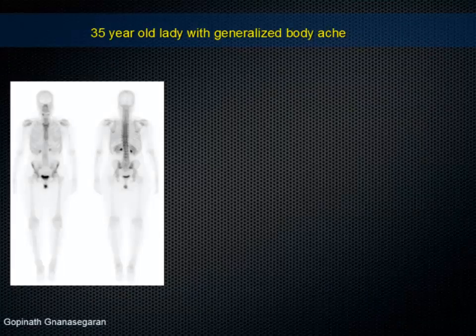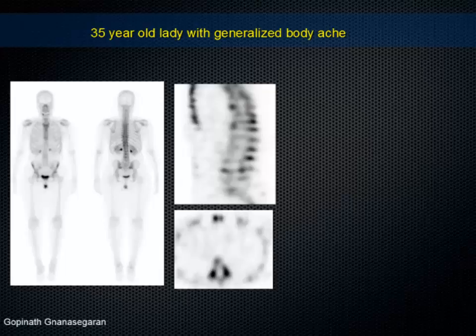Bone scan looks more or less okay. I will not worry too much. There's some patchy uptake in those areas, but otherwise more or less this we see very often. That's normal. Patchy uptake, dental uptake is more or less benign dental pathology, except for subtle inhomogeneous uptake. That's quite non-specific. Then you do the CT, you do the SPECT, then again it's heterogeneous, it's non-specific.